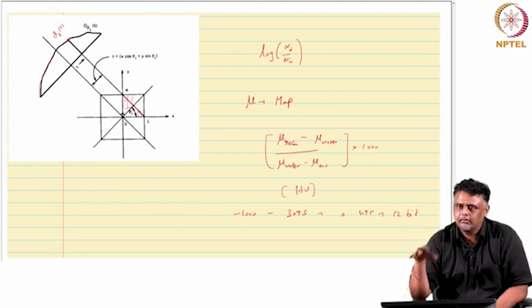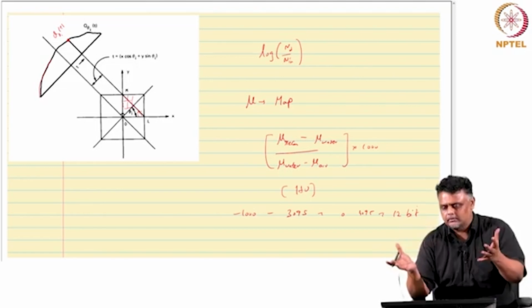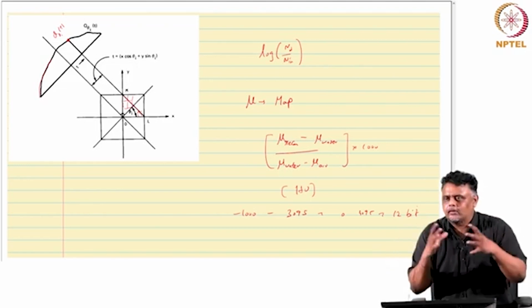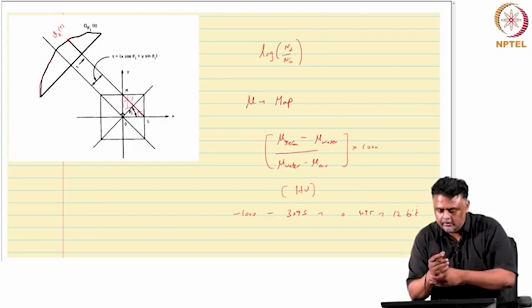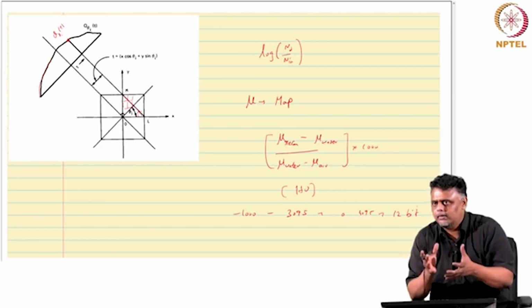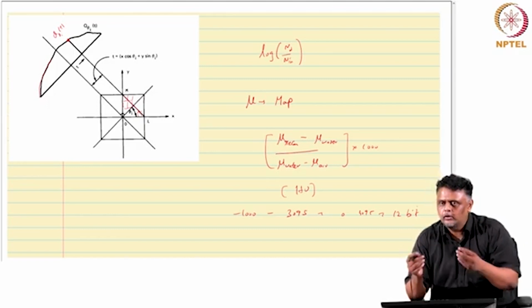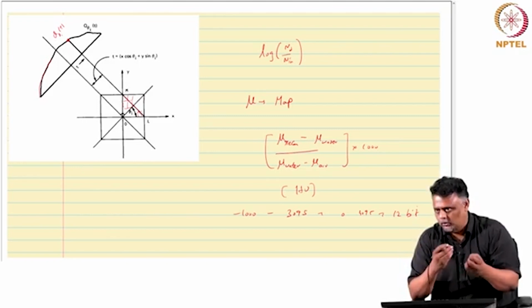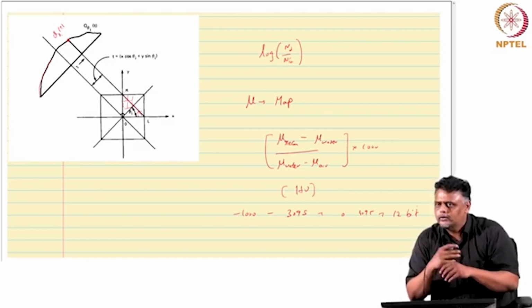If you take what is called a phantom, an object that you create to scan in a CT scanner, like a plastic bag of water, scan it here, then go to some other scan center and scan it, the pixel values you will get will oscillate around 0, that is mu water, or 1000 in this case. If there is noise, it will vary around it. So that value is fixed.